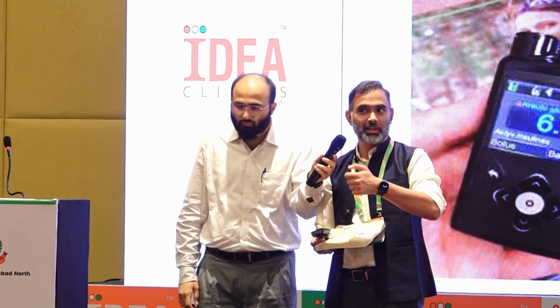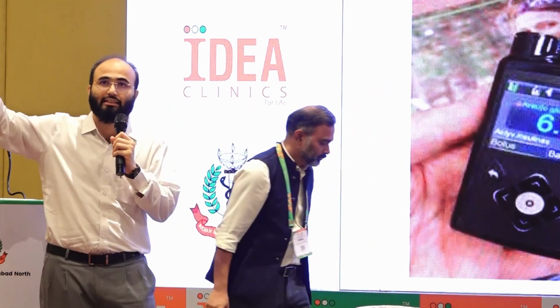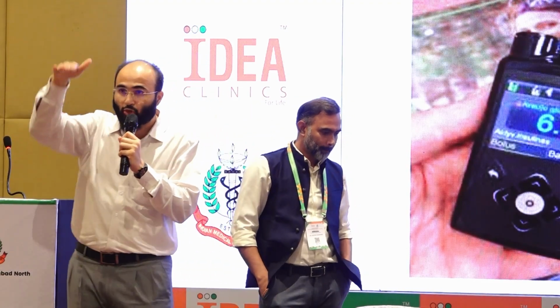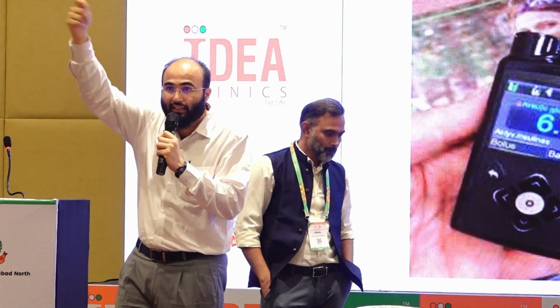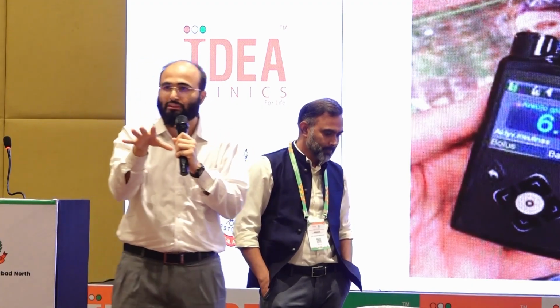The algorithm which decides how much insulin to give, that is the costliest part, because safety is most important here. You know, I think we are in a centrally air conditioned place. There's a temperature that is set to it. If the temperature drops, it tries to bring it up. If it goes up, it tries to bring it down. And this is exactly what the pump is doing.